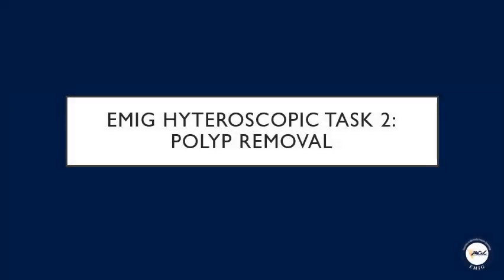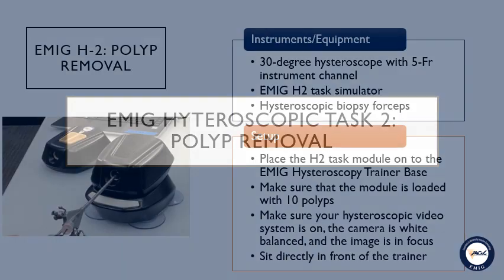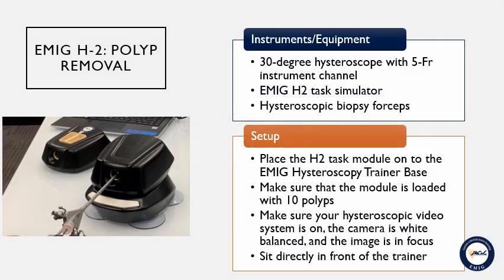Emig Task H2: Polyp Removal. For this task, you will need a 30-degree hysteroscope with a 5 French instrument channel, the Emig H2 task simulator, and a hysteroscopic biopsy forceps.